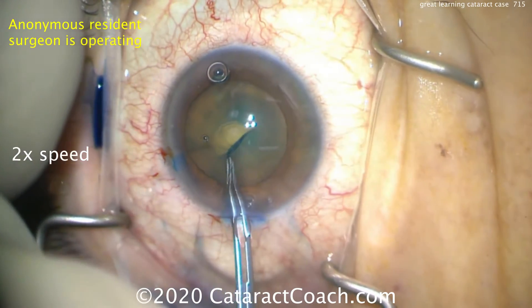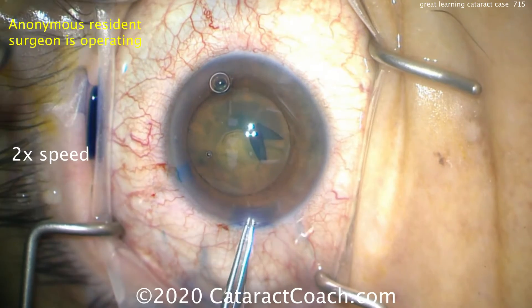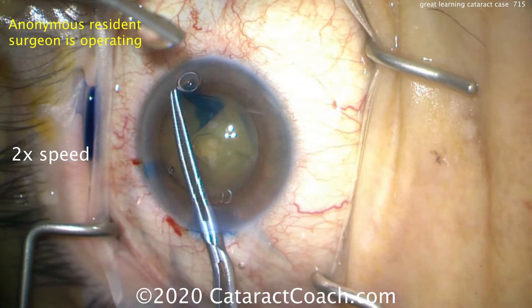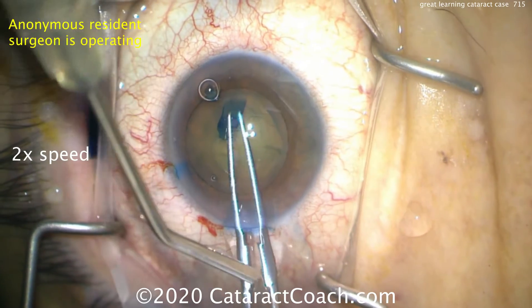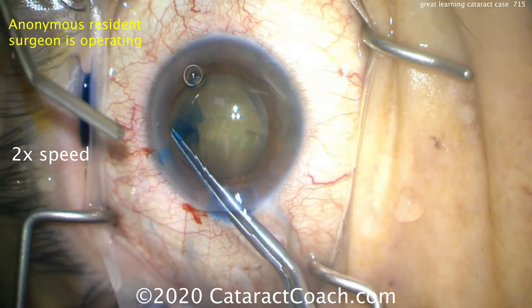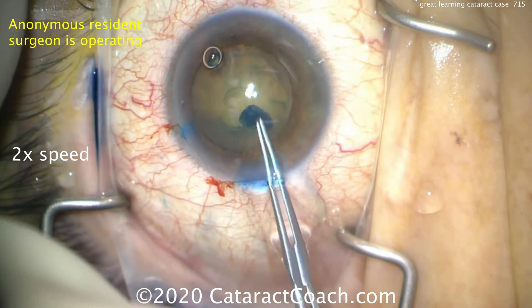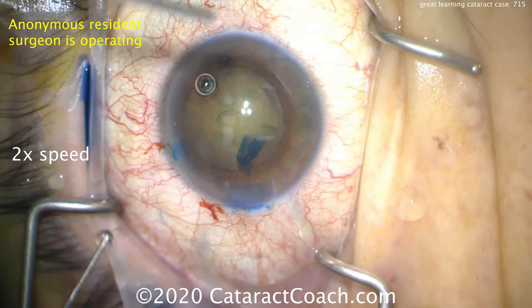During your training, it's perfectly acceptable to use as much trypan blue dye as you need. Once you get into practice, if you don't really need it, you're better off without it — not just the cost factor, but also eliminating extra steps. Creating a nice capsulorrhexis, a good reasonable size. Keep in mind the size of the pupil and the size of the capsulorrhexis — you can't always use the pupil as a guide. A generous capsulorrhexis, what seems too big is going to be just about perfect, aiming for about five or five and a half millimeters. I'm instructing the resident to pivot more in the incision to get a good pivot and not distort it. And there's completion of the rhexis — that looks great.